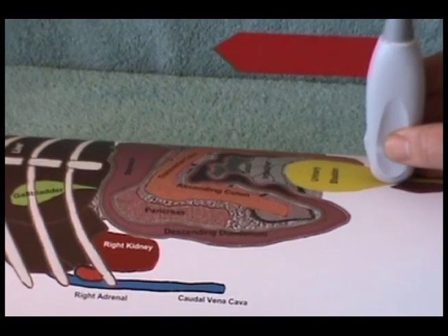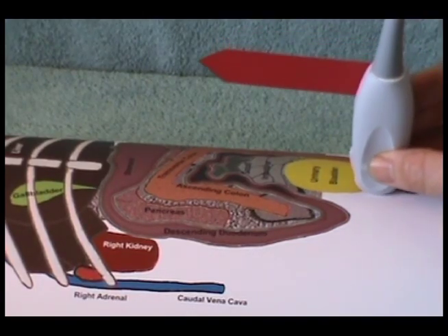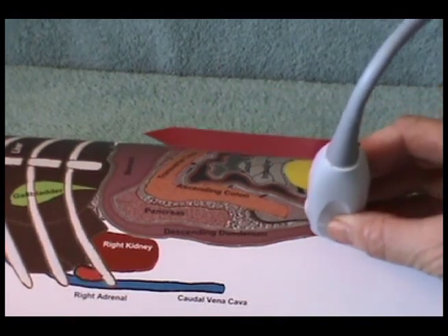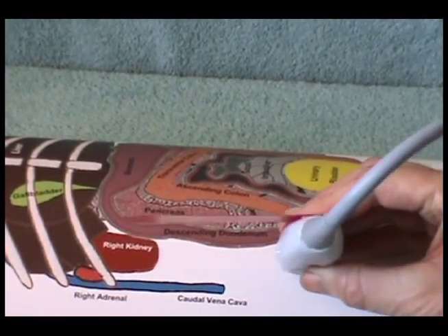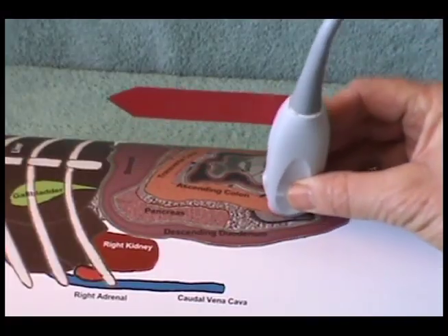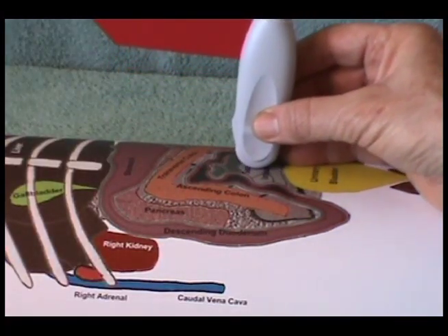From the urinary bladder and prostate, we will move the transducer to the right kidney. We will accomplish this by moving in a zigzag pattern from the ventral midline sagittal position to the right lateral sagittal position and back again. We will move slowly cranially as we move toward the right kidney in about 3 passes.